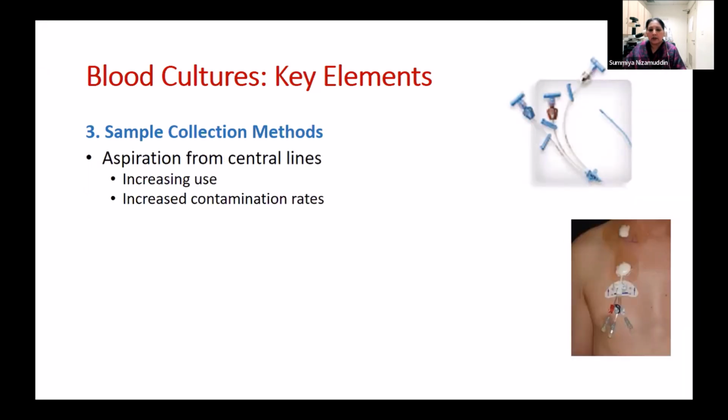And if for example your patient is admitted in the hospital and he has central lines in place, or perhaps the patient has any PICC lines in place, इसके भी instructions हैं अलग से. Now advice ये है कि routine blood cultures should not be drawn from these catheters or these central lines, because these catheters may be colonized or they may be contaminated, so that will once again lead to false positivity of your blood cultures.